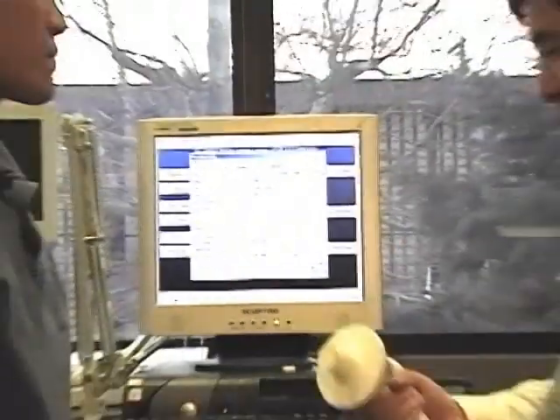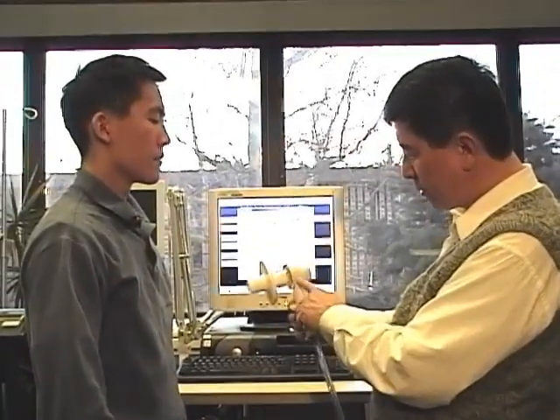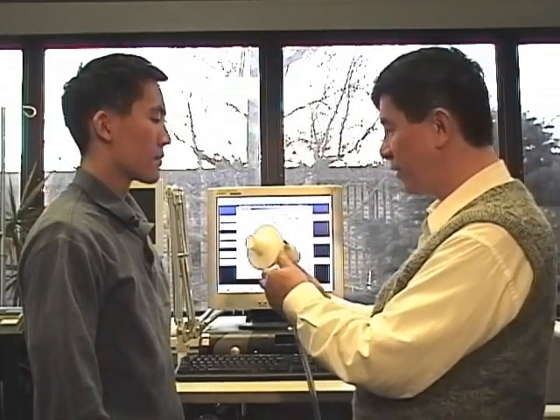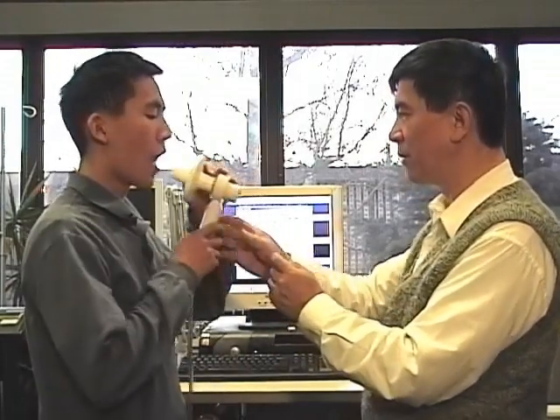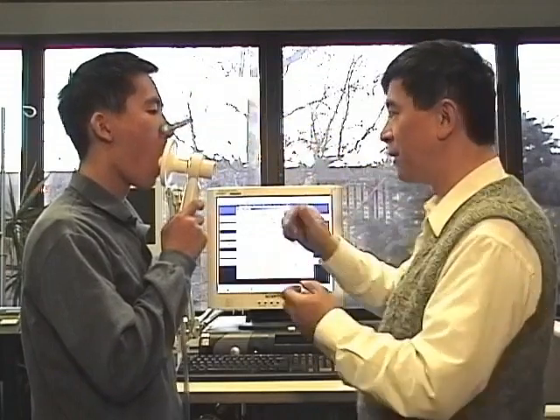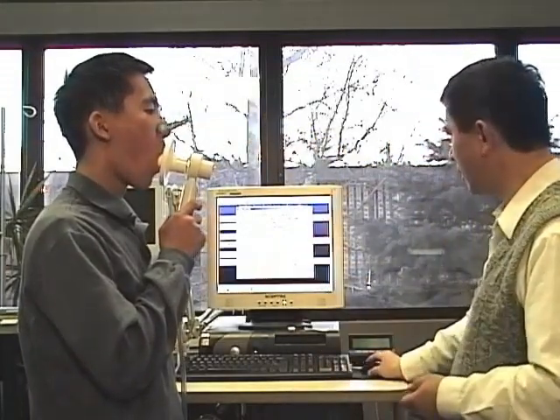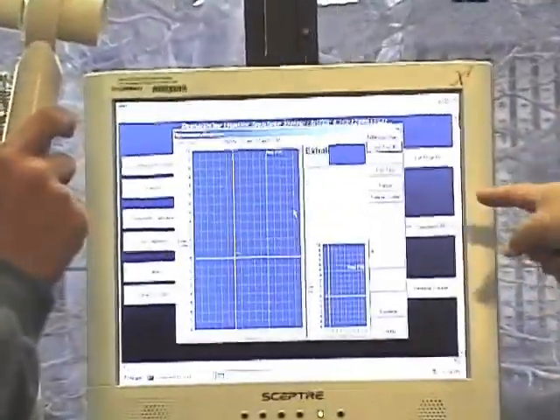Then you put the handheld pneumotach with a filter to the subject. The long end of the filter should be into the mouth of the subject. Then you clip the nose, click OK, and you will have a one-point baseline.